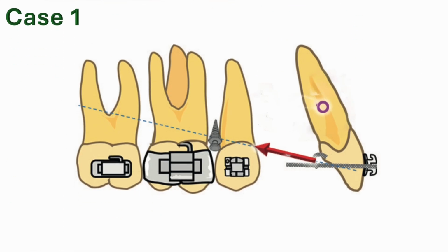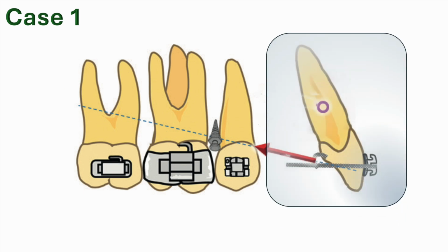In the first picture, we can see that we use the segmental arch wire that only goes along the anterior teeth. So the anterior and posterior teeth are independent. So in this case, the active unit is only the anterior segment.